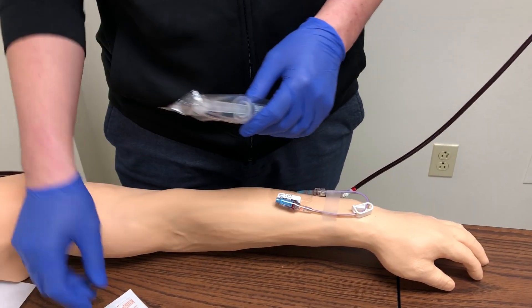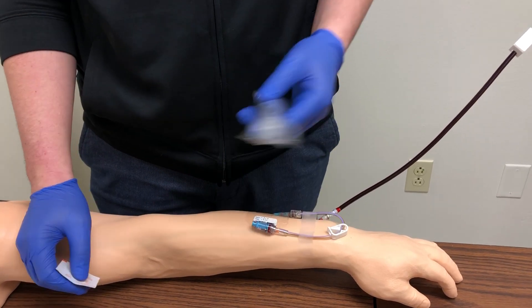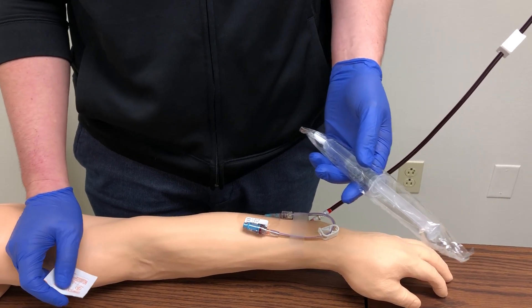So we're going to go in the room, identify our patient, explain the purpose of our procedure, perform our three checks, use the BMV scanner, and then we're ready to go.